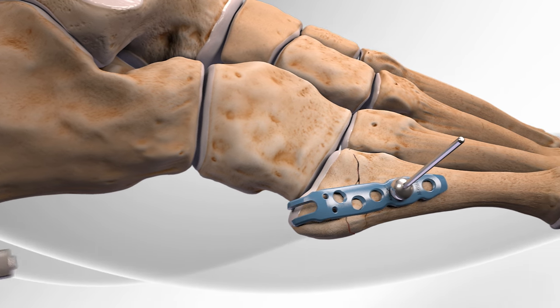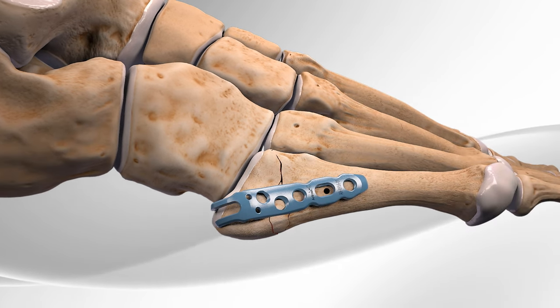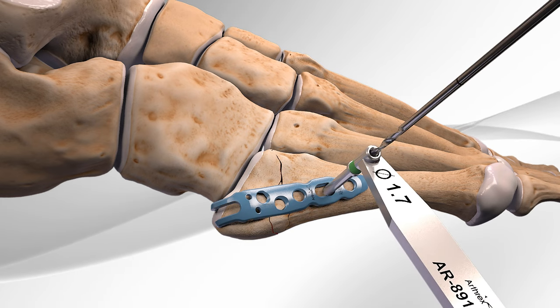The tack-like device is then removed from the plate and a drill is used in the oblong-shaped hole to create a space for the first screw.